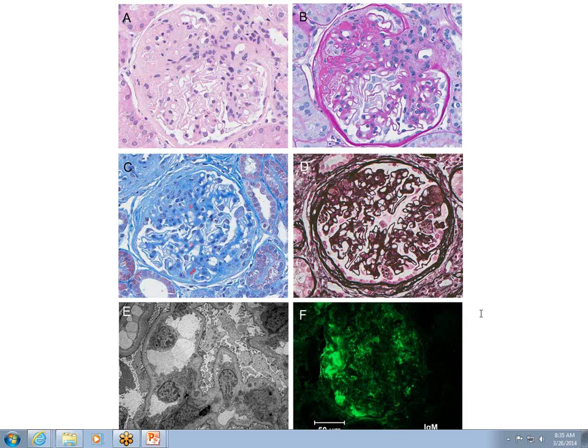So sclerosis means that you have effacement or compression of the peripheral capillary loops, and it's due to extracellular matrix. If it's just mesangial expansion, that's all I say.